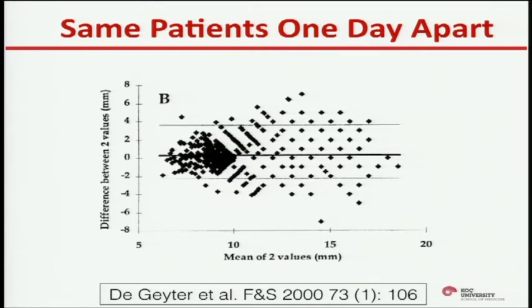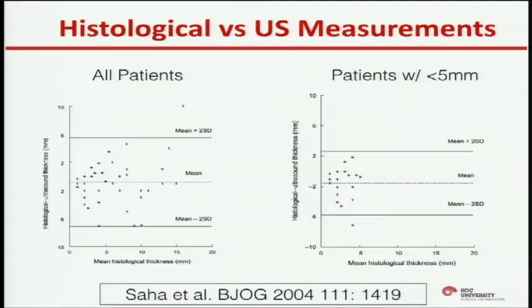I'm sure you have all come across patients, especially when you needed to do consecutive scans, like under risk of ovarian hyperstimulation syndrome, etc. So you sometimes get the impression that you measure the endometrium smaller than the day before, which may make sense or may not. Slightly oblique section, or actually getting smaller, who knows?